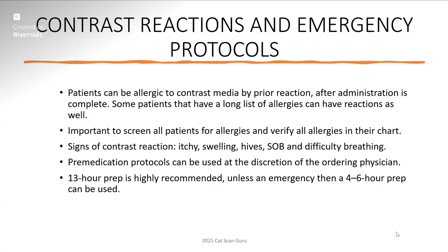Now, signs of contrast reaction: the patient will get itchy, they'll start to swell, look like Stay Puft the Marshmallow Man, they'll get hives, get short of breath, have difficulty breathing, tightness in the throat, tightness in the chest. So make sure you know how to recognize the signs of contrast reaction. In the event of that, you have your rapid response team, you have your reaction box, things like that. And then your pre-medication protocols can be used at the discretion of the ordering physician or whatever your radiologist would like you to do.